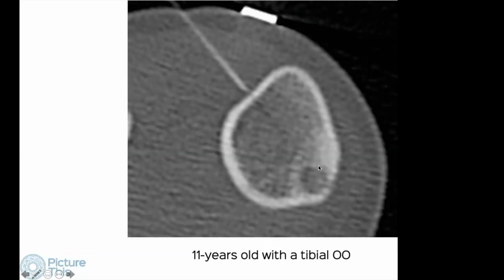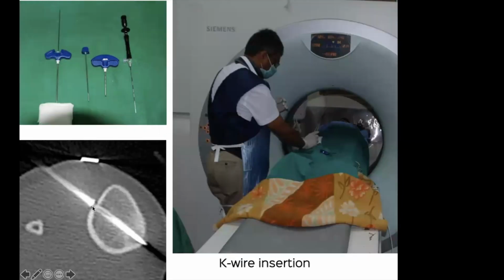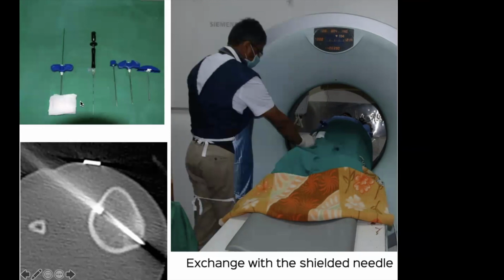So the first thing you take is an 11 gauge needle and drill it into the bone. Then you put the K wire in and position this properly. Then, for the Rita electrode, you have to remove the non-shielded needle and put in the shielded one here. Then remove the K wire and exchange it with the electrode.